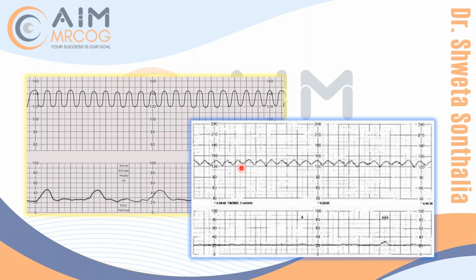Anything could happen. And it will be fixed, which means the pattern doesn't change. It's the same height and same breadth. So it's not changing. So it's not variability. It's a sine wave pattern. So this is how the sinusoidal trace looks like. That's the importance. Then it should be at least 10 minutes, and it shouldn't recover. If it is for 10 minutes and then it disappears and becomes better, then I'm not going to label it as sinusoidal pattern. So if we already started, are you able to listen?